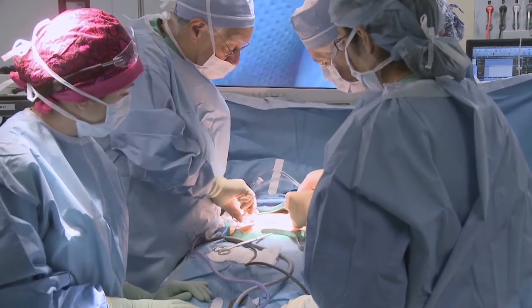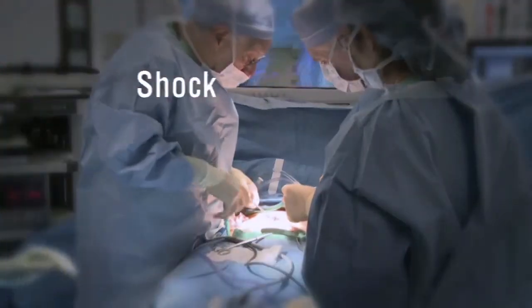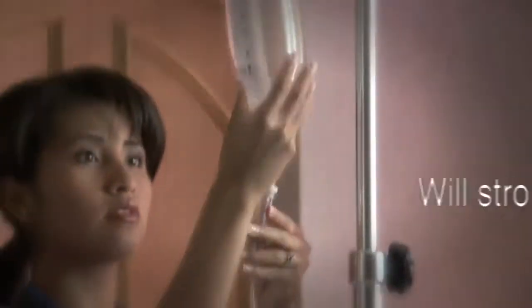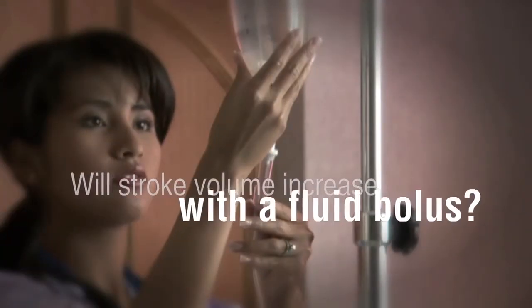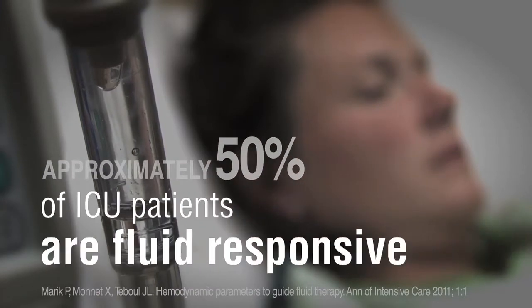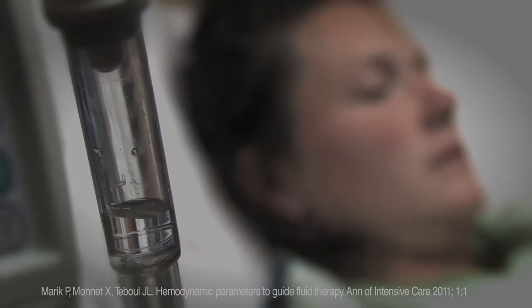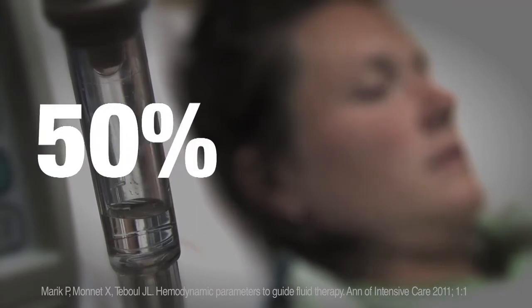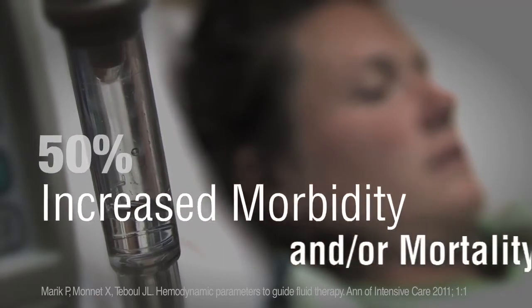In many diagnostic scenarios, clinicians must determine if the patient is fluid responsive. The key issue is whether stroke volume will increase with a fluid bolus. This is important because approximately 50% of ICU patients are fluid responsive. For the other 50%, increased fluid is associated with increased morbidity and/or mortality.